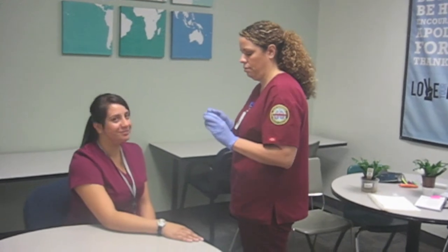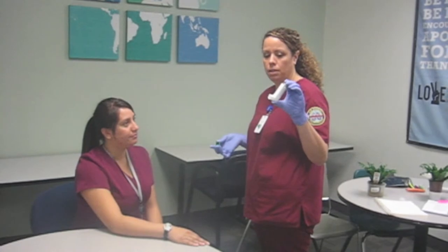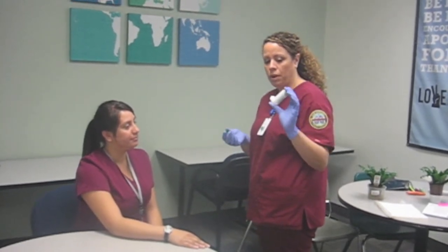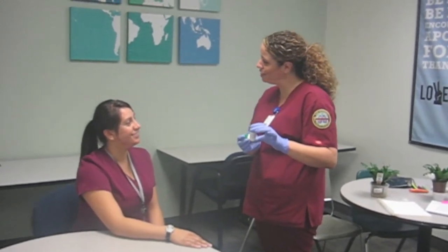And then we're going to take off this cap and go ahead and pump it a couple times. That way, if there's any dust or particles we don't want in there, we're just cleaning it out before we administer the dose to you. Do you have any questions?